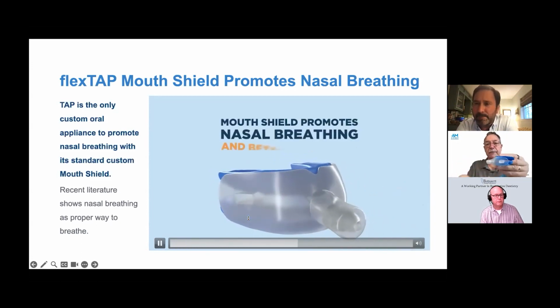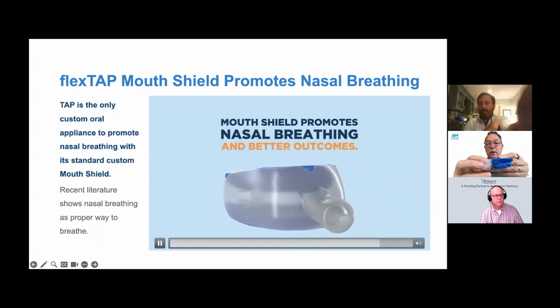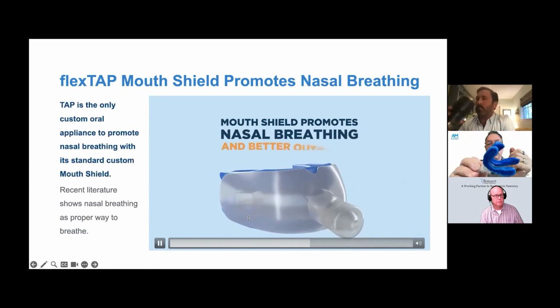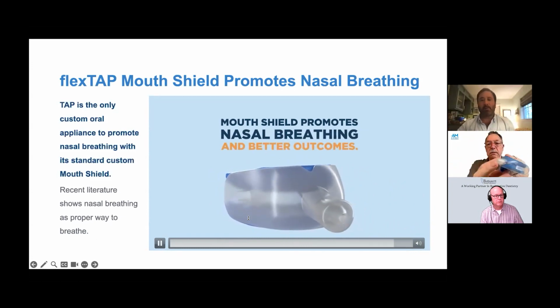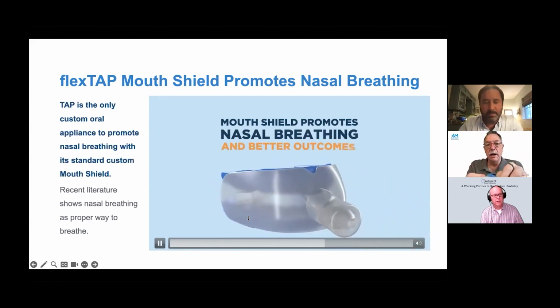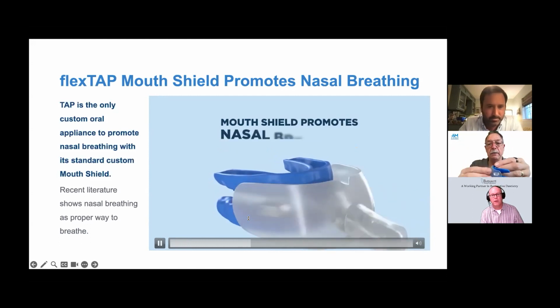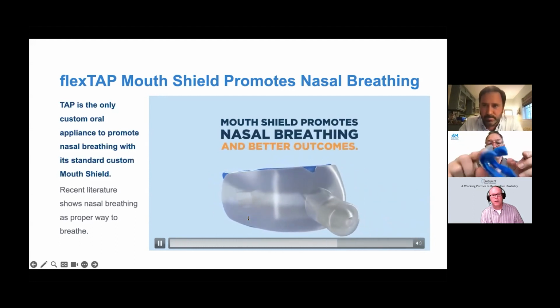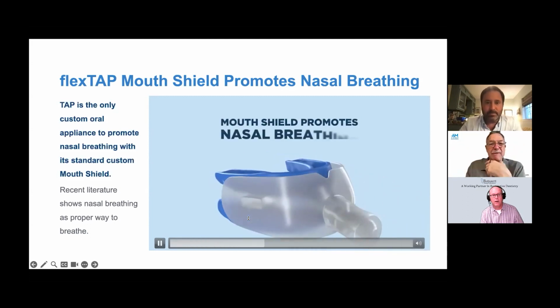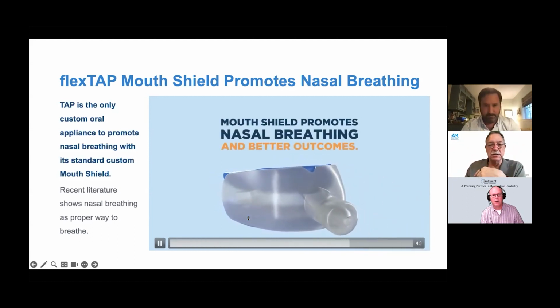Well, I can say that if a patient wants to, they can just place it over the post, put this part in the mouth, and then tuck this in under their lips. I frankly would just let them do it the way they want to do it. I think most of my patients do this. They put it all together. That's how I put mine in, and I just put it all in and bite into it and it works. It's pretty easy.